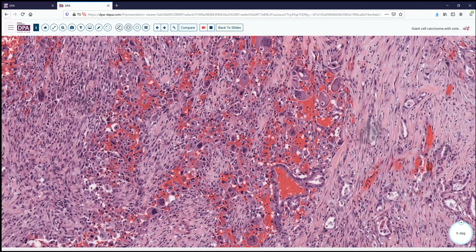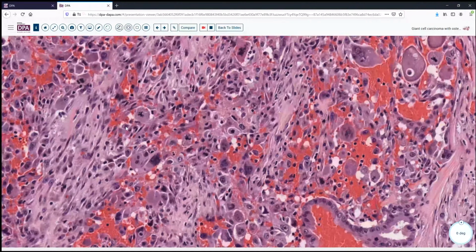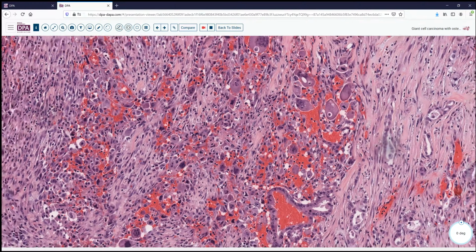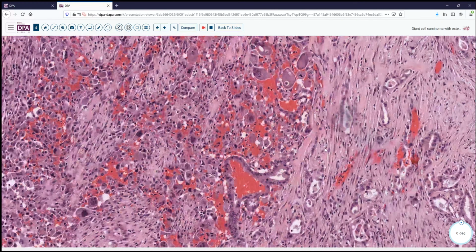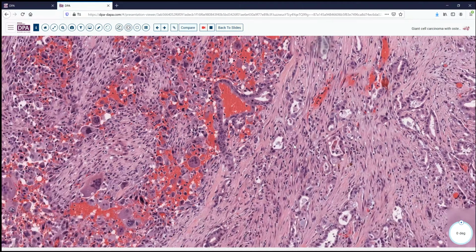Here we see a gland within this portion as well as these other high-grade malignant cells, and we can see some atypical mitotic figures in this very high-grade tumor. But it's one that is coexisting, perhaps arising from an area of more conventional type ductal adenocarcinoma of the pancreas.